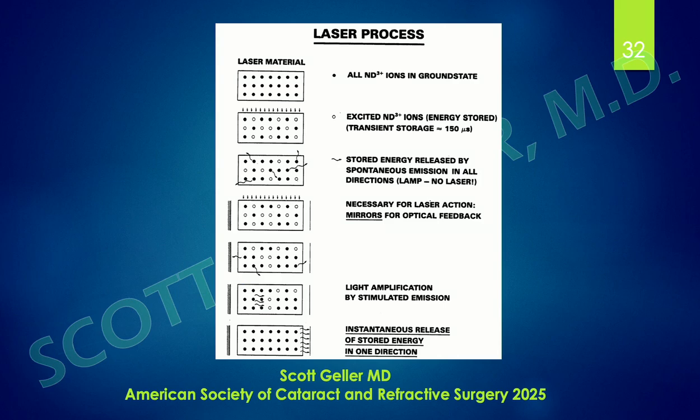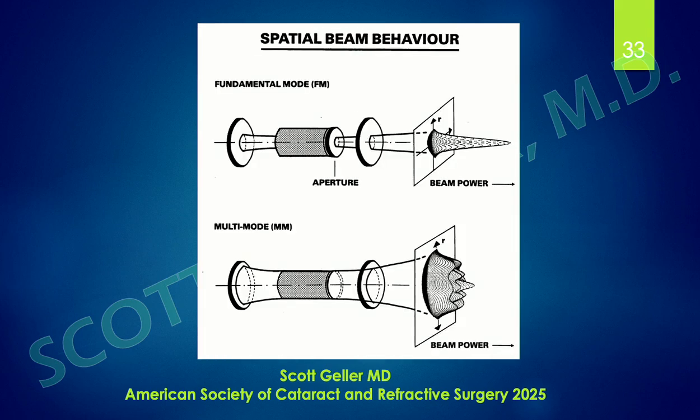Now, what is really necessary for laser action are mirrors for what's known as optical feedback. So laser, of course, is an acronym: light amplification by stimulated emission of radiation. When that happens, there's instantaneous release of the stored energy in one direction, because there's a 100% mirror at one end and a less than 100% mirror at the other end of the laser cavity.